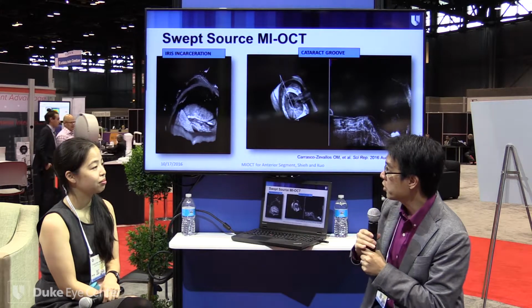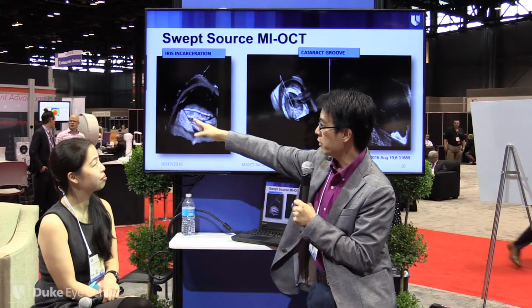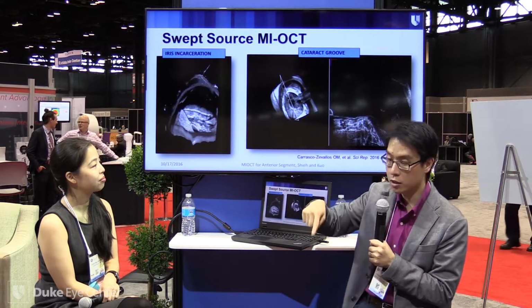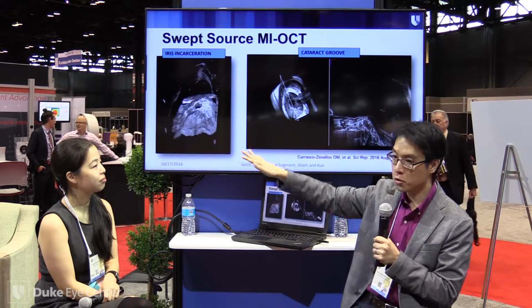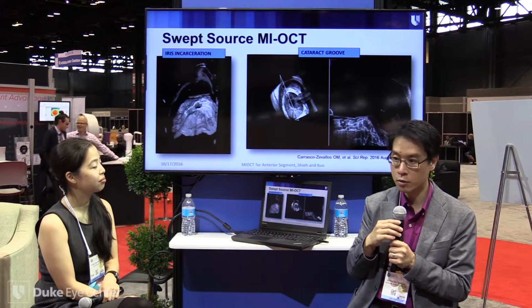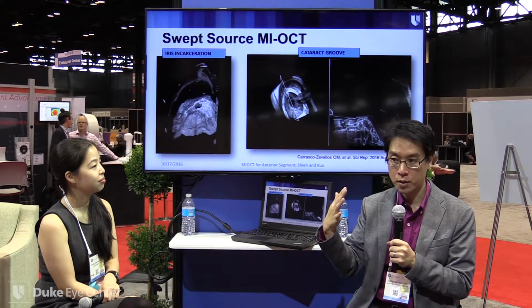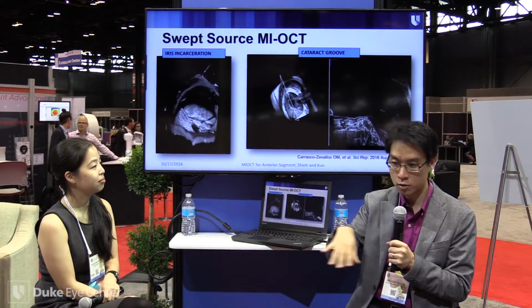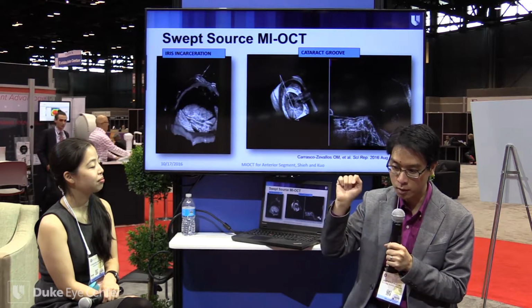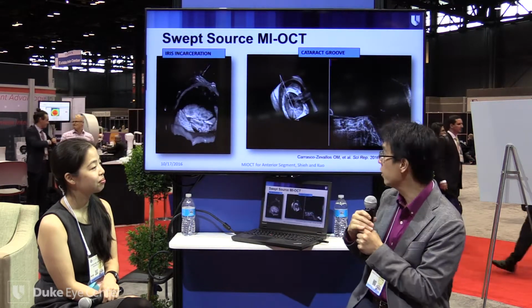These are some other examples. So this is in corneal transplantation. Here you can see the iris, or the colored part of the eye, stuck to the cornea. And so with a little viscoelastic, you can push that part down. The surgeon couldn't see that part rising up in the regular surgical view, so we just happened to see it as we were scanning with OCT, and we told them, hey, you need to push that part down. If you don't push that part down, that becomes permanently stuck, and then you affect the glaucoma drainage in that area. So this was really helpful for them to see, and we can guide them and tell them, okay, if you go down to the 7 o'clock area and push that down, that'll get that part away from the cornea.